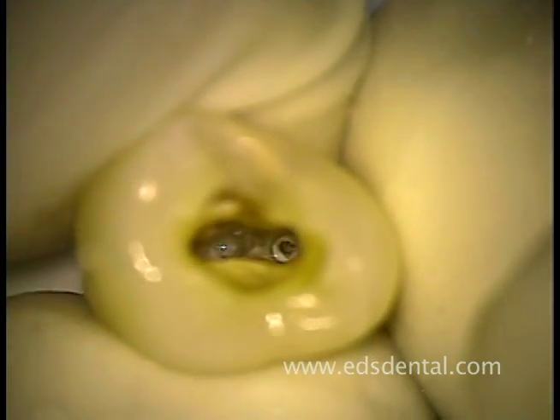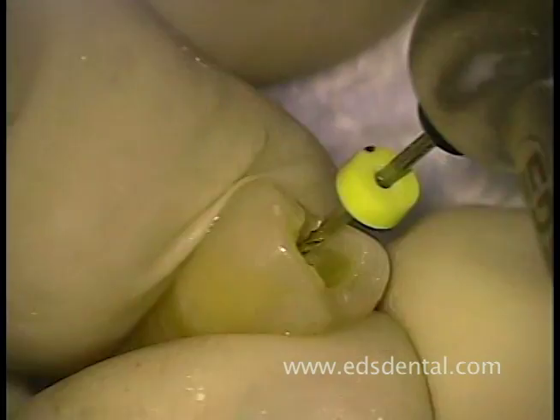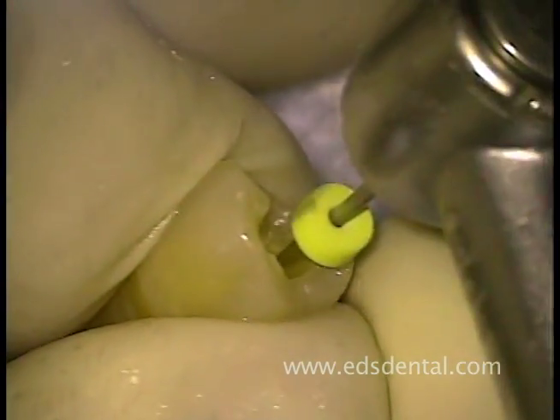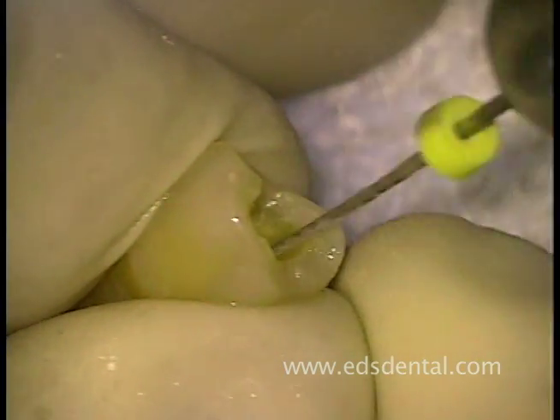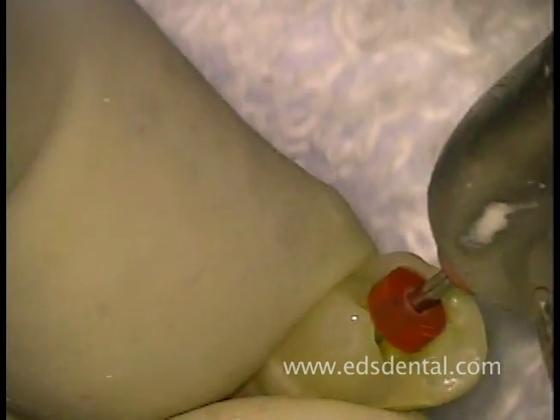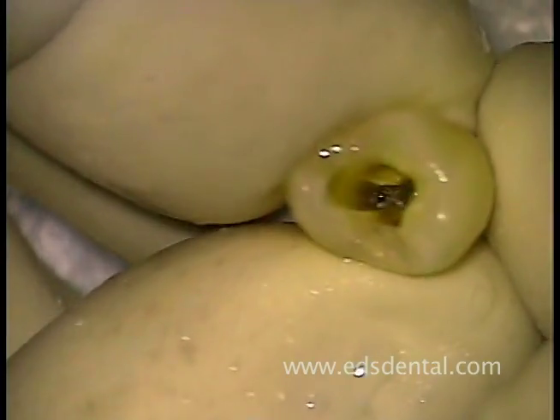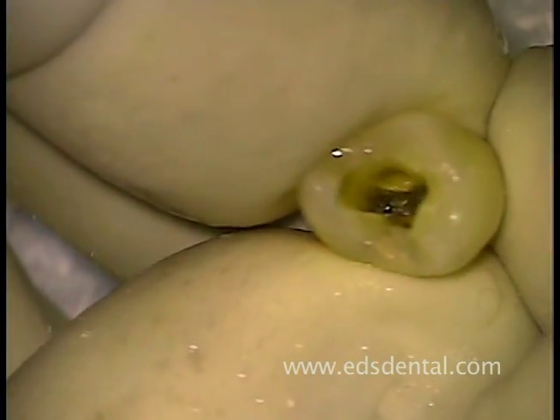Here you can see the pathway of each canal. With patency established, shaping the canal through a 40 takes a very short time. The final shaping of the canal is done with the 2506 relieved NiTi reciprocating reamer. After irrigation, you can see the final shape of the canal.